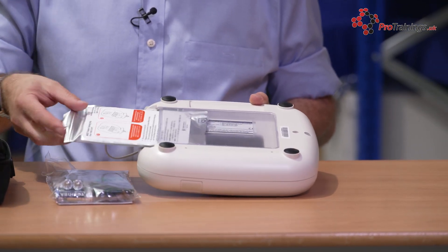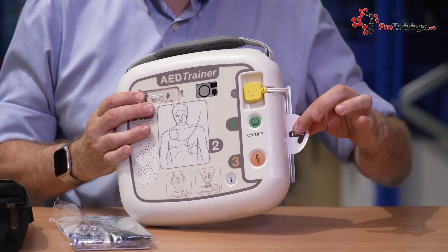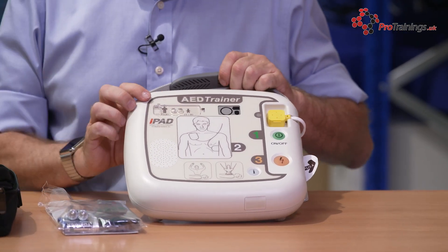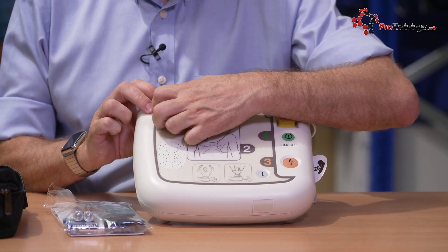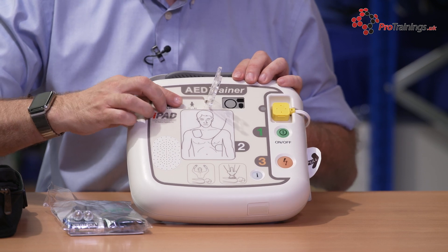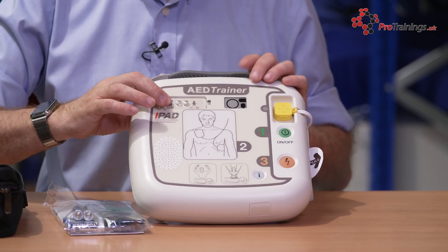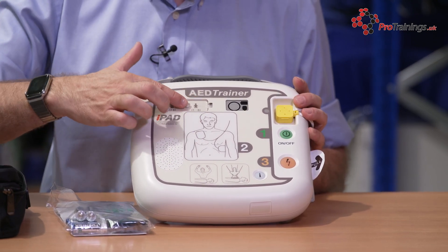The pads themselves slide back in there — from this side it's nice and easy. Like the live unit, you can see where you can pull the pads out. The other thing with the iPad AED is the adult and child setting. If you put your finger inside here, you can open the cover up and change it from child to adult setting. The advantage is it's impossible to accidentally put it into the wrong setting because once the cover is over, you can't move the switch.